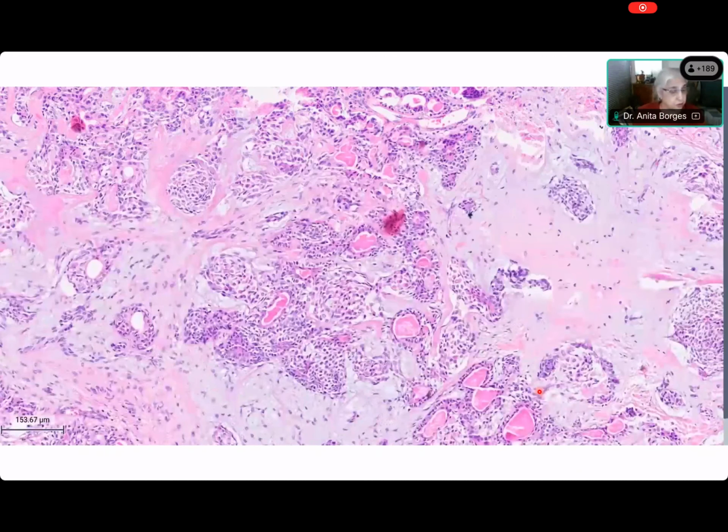All right, now what about this? Who was answering, Shivani? Yes, so tell me, Shivani. Now what do you see here? Of all of the things that I very helpfully gave you as the features of note, which feature of note are you seeing here? Ma'am, there is a microcystic area, which is a cyst lined by the luminal cells, and the cyst is filled with eosinophilic material. Was it there in the features of note, or are you just describing now? What features of note did I give you? You want to go back to the features of note? You have to have some amount of retentive memory. So tell me, what feature of note are you seeing that is hitting you here, straight in the face?